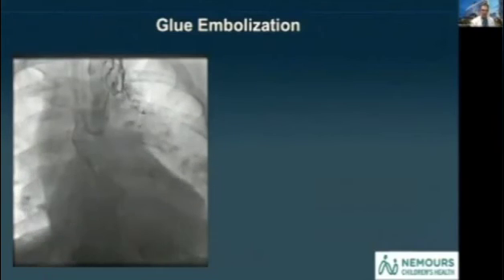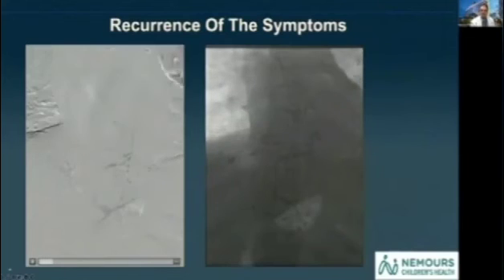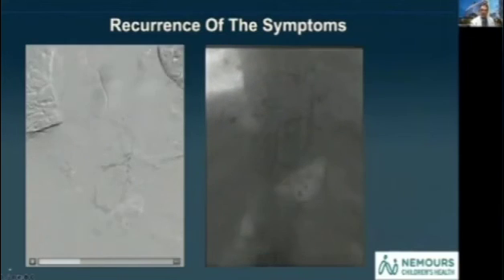I glued one part, and then the other, and the patient is doing better. But then he put himself on the keto diet, and immediately symptoms recur. You can see here, and unfortunately this patient is too big for us to do MRI, there's another parallel duct going in another direction in the chest. The moment we glued him, the patient on the right is glued, of course, the patient is doing excellent.